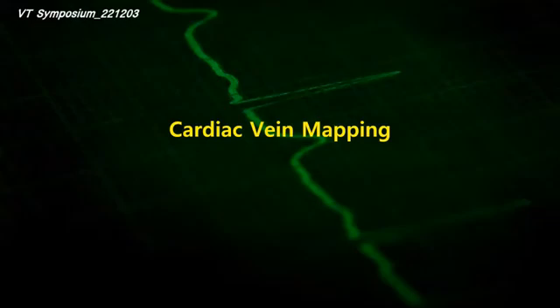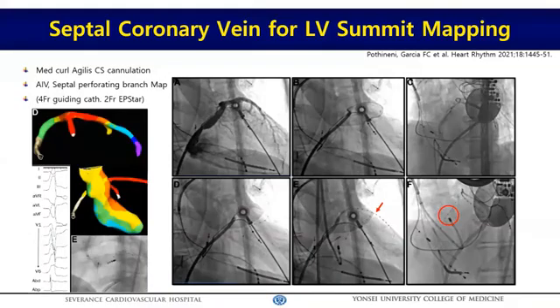Now, we understand the ventricle has a 3D structure and significant thickness. Although epicardial mapping might be very helpful in understanding the mechanism of VT, it is not practical to do epicardial puncture in every single patient without any evidence. However, the cardiac veins provide an excellent site for mapping, pacing, and potentially ablation.